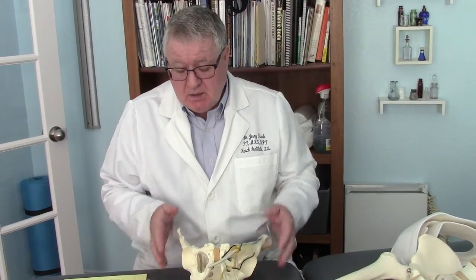If not worn too tight, the belt can be worn at nighttime, and I suggest always wearing it over underclothing. And I want to talk about a couple of myths. One myth is that the support will slip up when sitting, and it might depend on the type of support or how firmly it is applied. And I do favor wide supports, especially ones that are form-fitting to the shape of the pelvis.